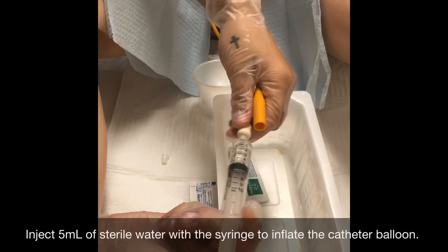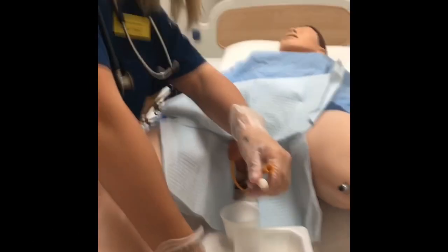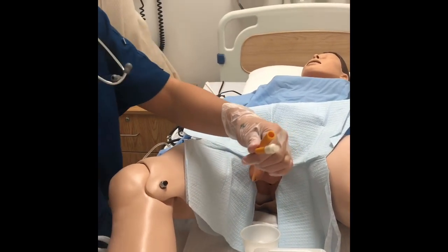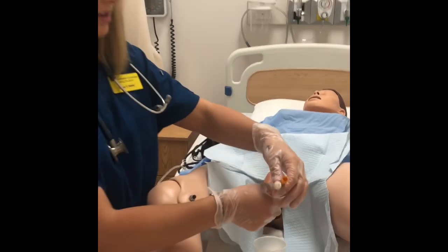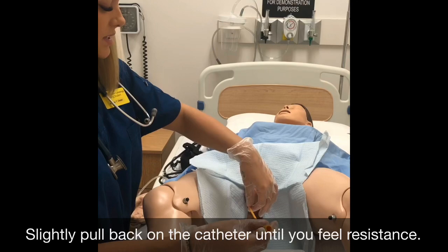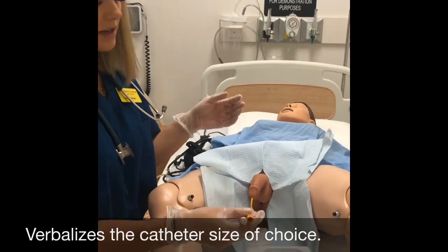Okay, so now that I inserted 5 milliliters, I'm going to take out the sterile water, put it back on my sterile field, and get the drainage bag and attach it. Or sorry, before I attach the drainage bag, I'm going to pull back to feel resistance to make sure the catheter is in place. And the catheter I used is a 16 French.